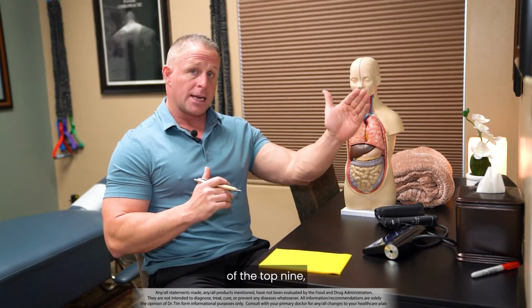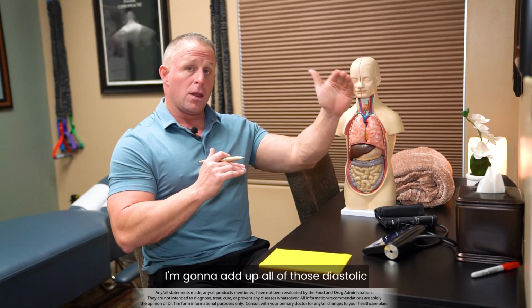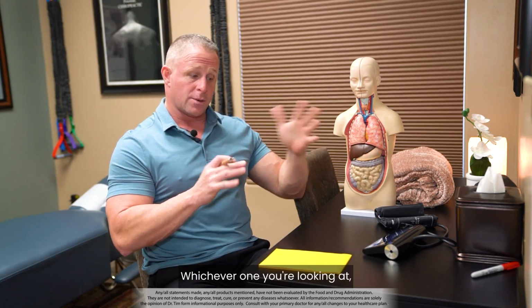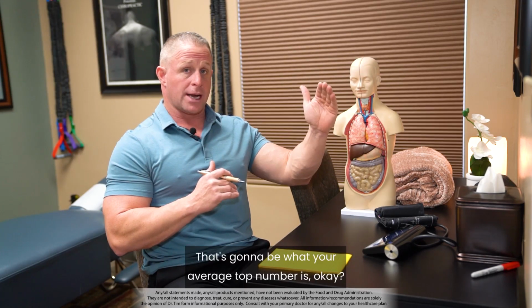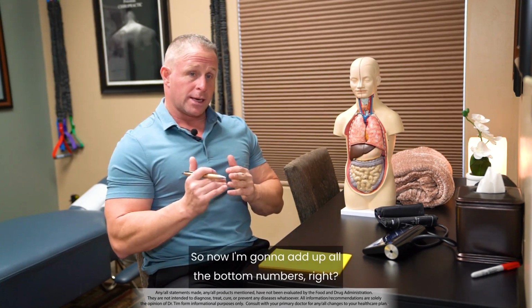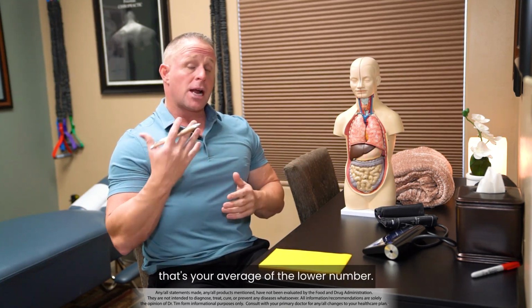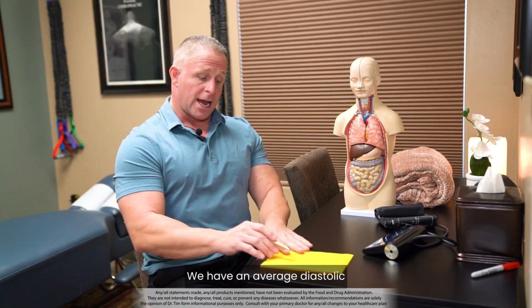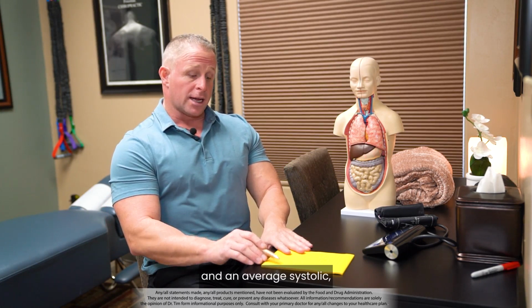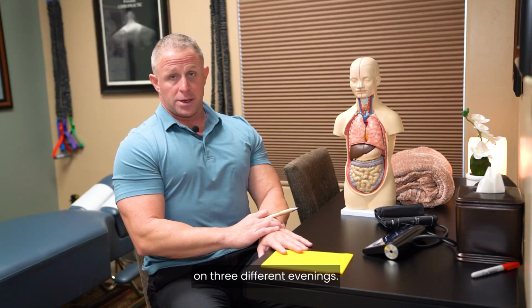And so now that I have those 9 measurements, what we're gonna do now is take an average of the top 9, and then we're gonna take an average of the bottom 9. So with the top 9, I'm gonna add up all of those systolic numbers, okay, whichever one you're looking at, the top or the bottom, add all the top numbers together and then divide that by 9. That's gonna be what your average top number is, okay? So now I'm gonna add up all the bottom numbers, right? 85, 83, whatever those are, add up all 9 and then divide that by 9. That's your average of the lower number. So now we have an average of 9 different measurements. We have an average diastolic and an average systolic, that's the number we're concerned about. The average of all 9 of those different measurements on 3 different evenings.